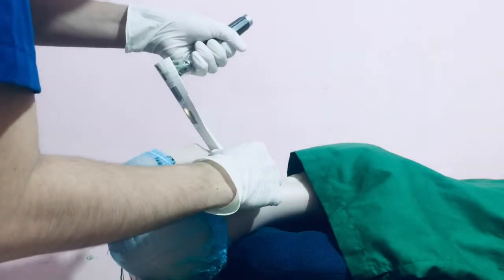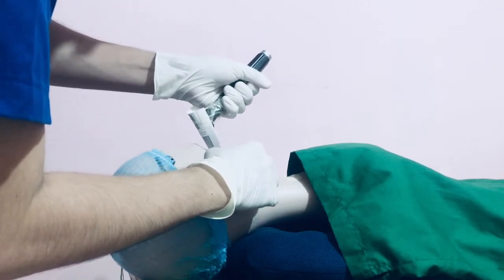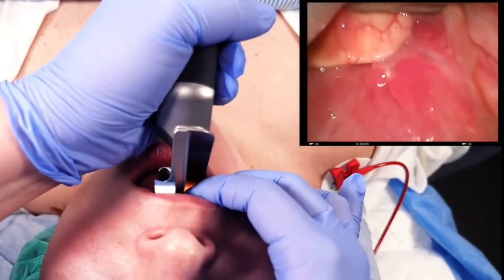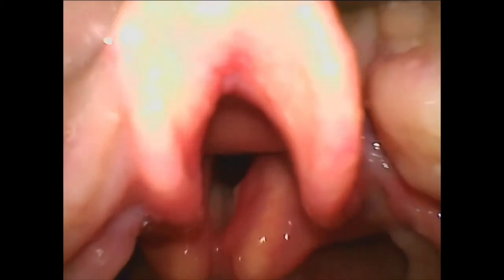Hold the laryngoscope with your left hand and insert the blade in an anterior-inferior direction along the right corner of the mouth and sweep the tongue to the left. Advance the tip of the blade until the glottic opening is visualized. The wrist must be kept in fixed position and wrist motion avoided to avoid leveraging on the maxillary teeth.